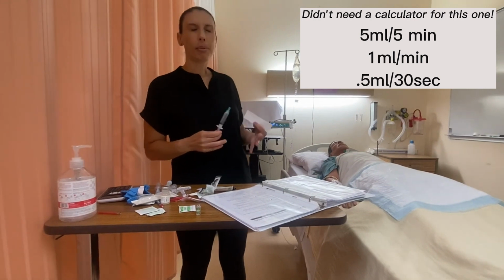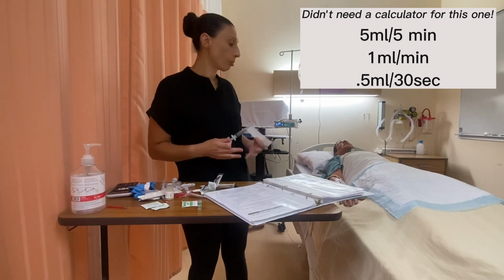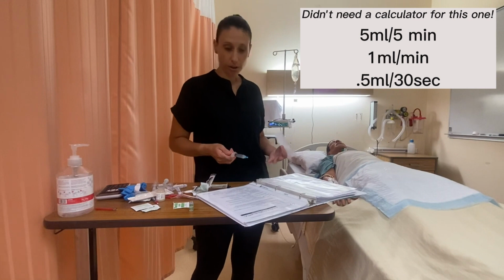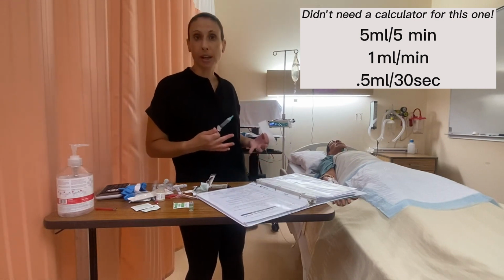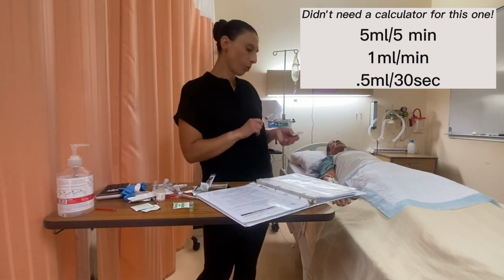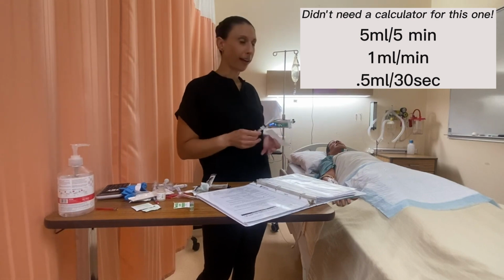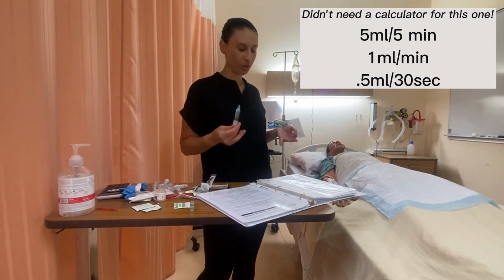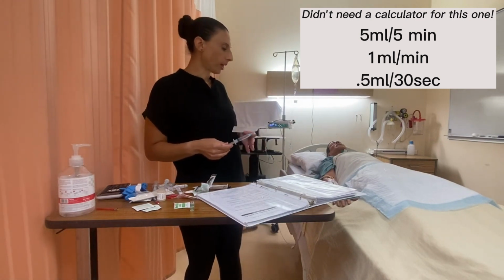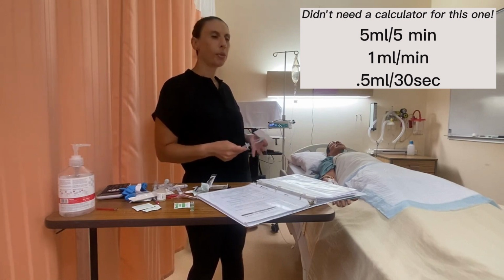If my patient has never received this medication before, I might want to give it slowly. So maybe over 5 minutes. If my patient has had this medication before, I would give it over maybe 4 minutes. Okay. If it doesn't really matter, you could just pick whichever one is easier math. So for me, I have 5 mLs. I'm going to give it over 5 minutes. Easy math, 1 mL per 1 minute. So it's very easy. If I want to break that down a little bit farther, I'm going to give 0.5 mLs every 30 seconds. So that's how much I would push.